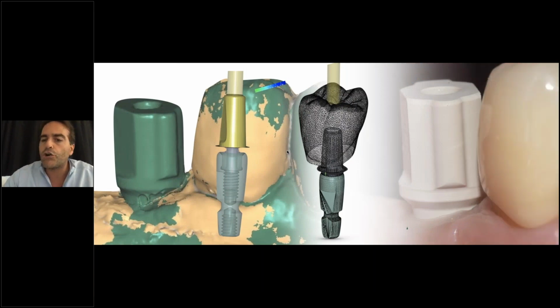Here we have a few of the components that we will then discuss in more detail that we need to create these workflows. We need, of course, to have a scan body. We need to have an intraoral scanner. We need to have a CAD software in order to coordinate all the information that we as clinicians are sending through the cloud to our lab technician in order to then produce through a milling machine the final restoration.